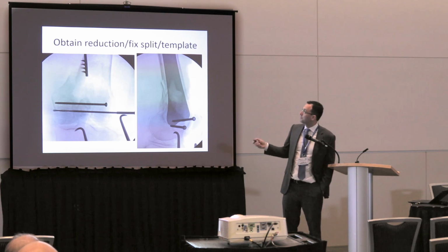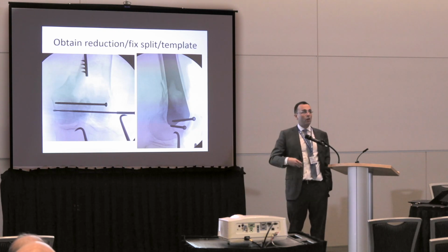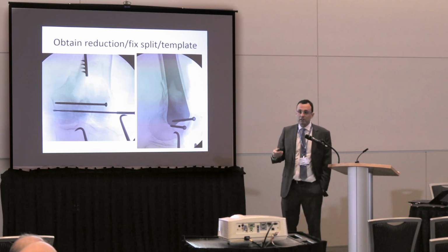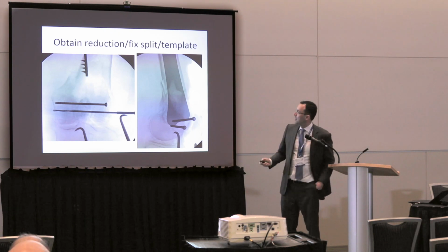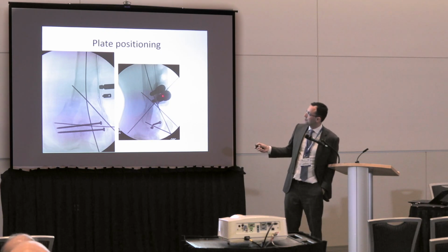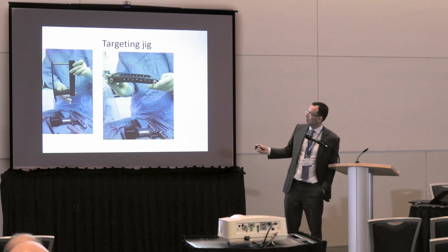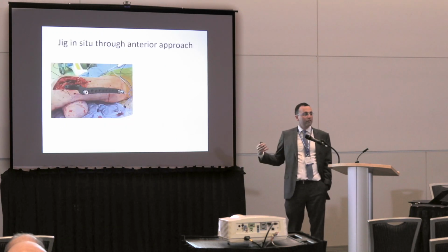So just like you do, you obtain and fix your reduction, very similar. This thing right here is a template that you use to tell you how long of a plate you need, right? Because with your metal implants, you put it up, same thing. This is actually the plate. You see this? The plate is being positioned, and this is common. It's a jig just like you use anywhere else. You make the box, very easy. You put K-wire, K-wire, and this is what it looks like, right? So again, very similar.